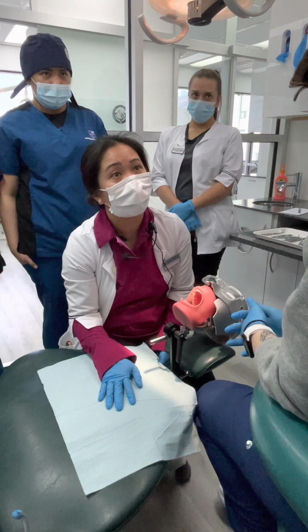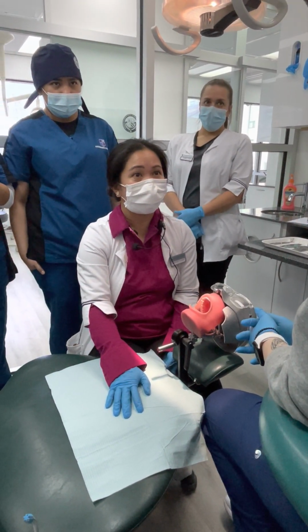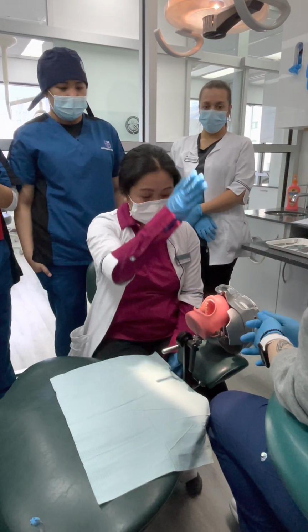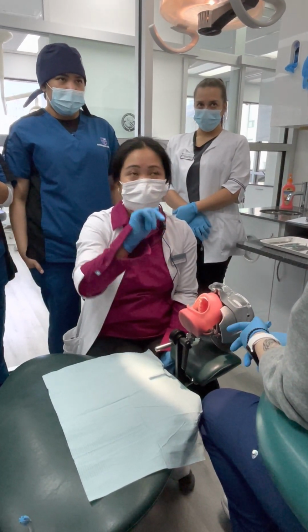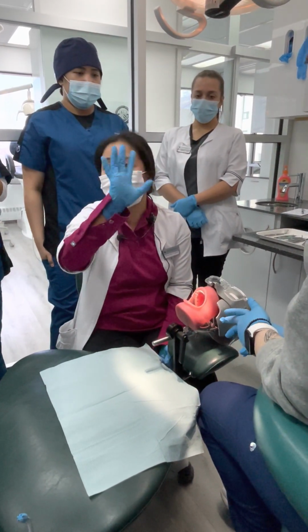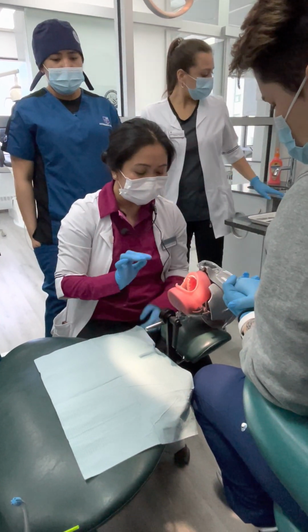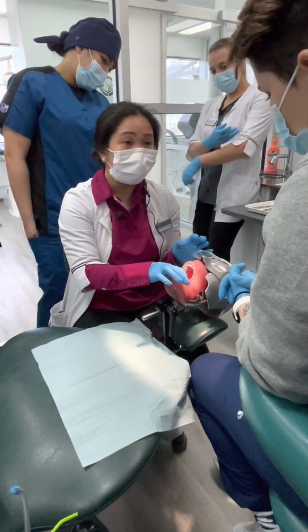Is the patient opening the mouth at that time? No, not yet, but you just estimate and adjust the light. Of course, during the procedure, you have to keep on adjusting the light, right? Okay, now here we're gonna work on, for example, 3-5.